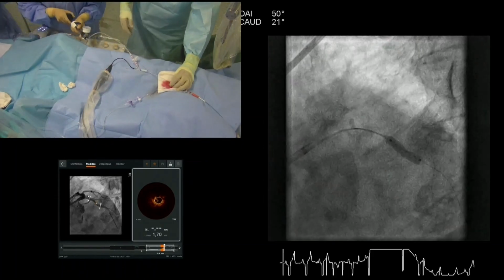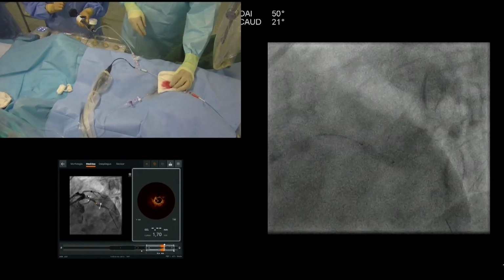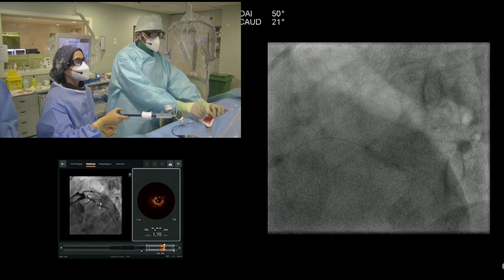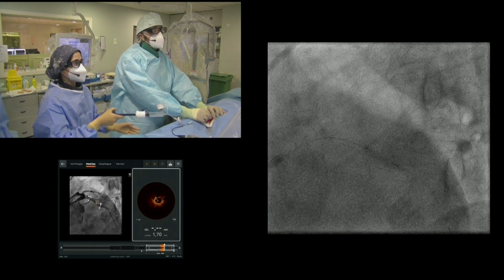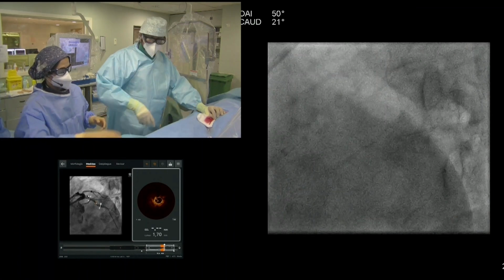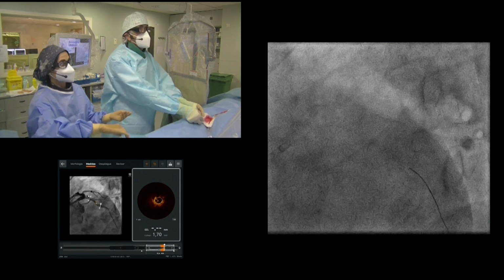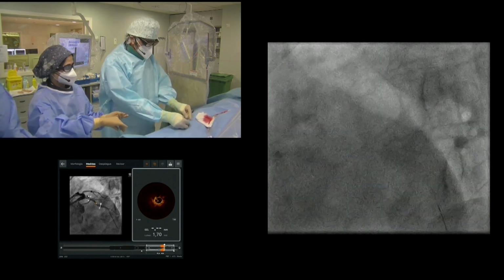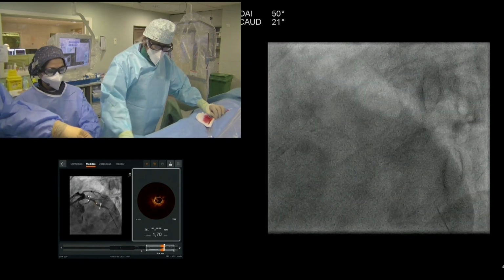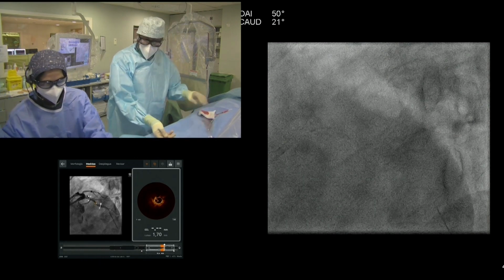And this is very good news, because then we can go directly to stent expansion without further predilation. I think it's always very good. We know that the balloon, at only 4 atmospheres, was able to expand this. So in case there is any recoil in OCT, we know that we have modified the calcium already, and at the time of bringing the stent, we will be able to expand the vessel again. But it's very good to understand the action that IVL has had on the plaque, with any technique, of course, not only IVL.